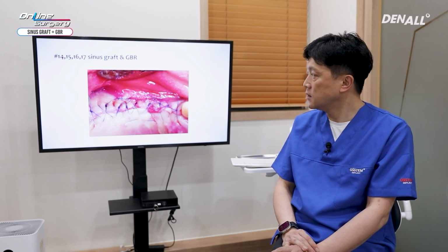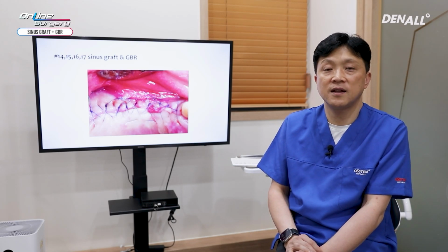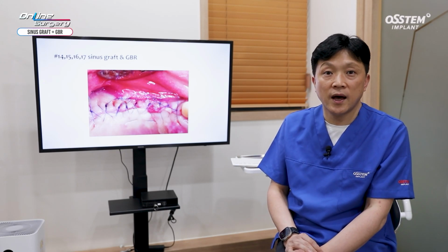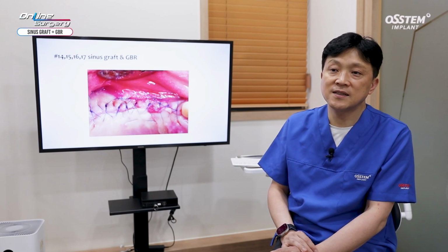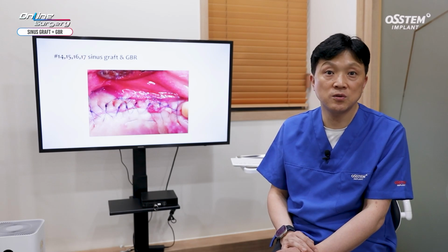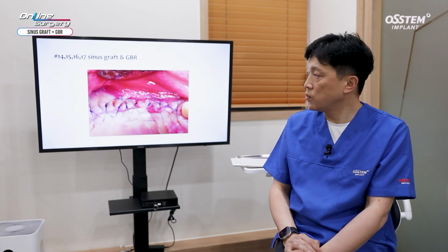When you do sinus graft and augmentation GBR at the same time, in my case, I do sinus first and then move on to GBR. There's no special reason, but if you do sinus first, then you don't need to worry about it any longer and proceed with GBR. So that is my preferred method. By doing this, you can reduce surgical time because surgical time is considered critical in such cases. It can minimize the various complications the patient may encounter after surgery and reduce swelling as well.